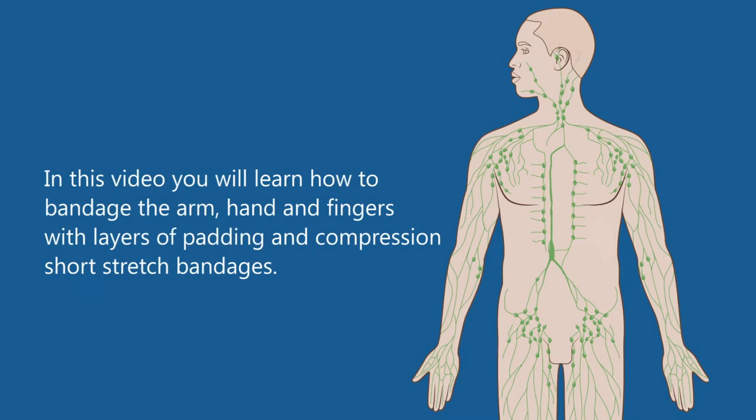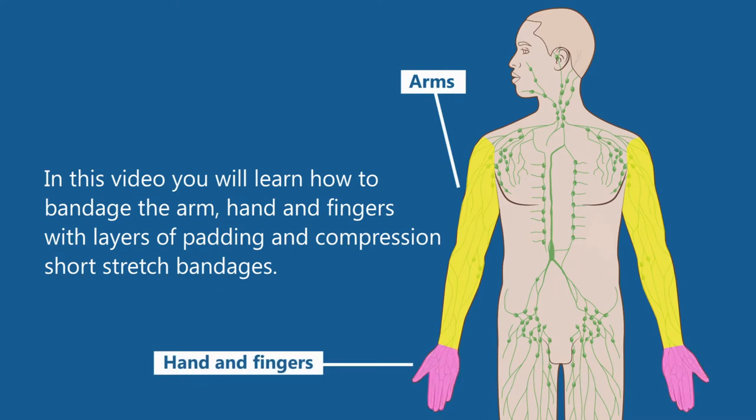In this video, you will learn how to bandage the arm, hand, and fingers with layers of padding and compression short stretch bandages. You can do this by yourself or with the help of a friend or family member. This video will show you how to bandage your arm, hand, and fingers on your own.